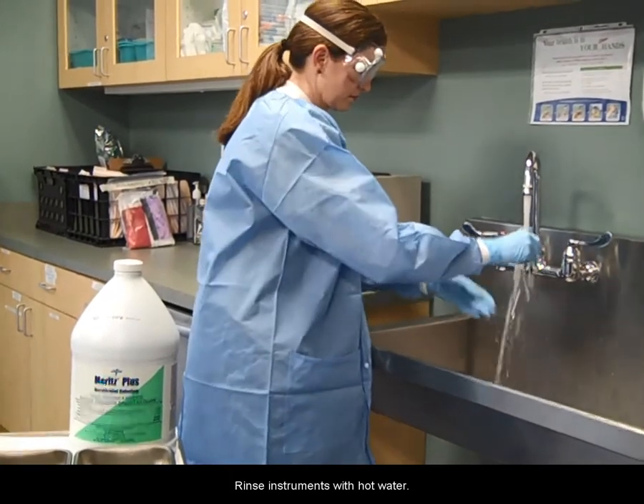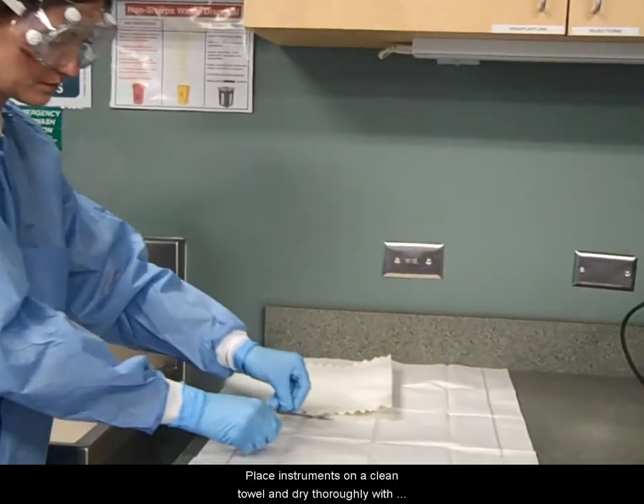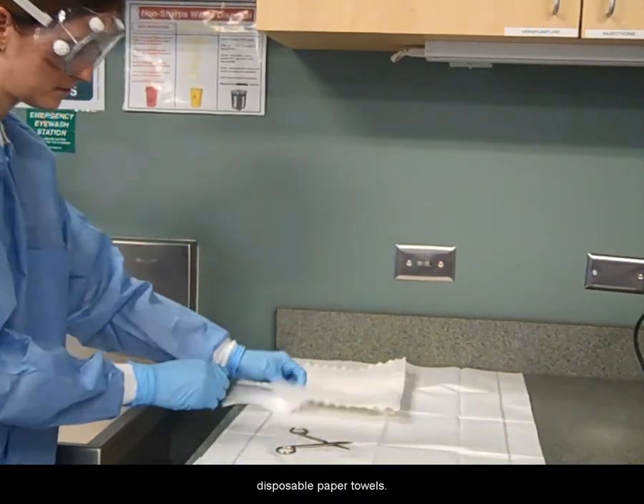Rinse instruments with hot water. Place instruments on a clean towel and dry thoroughly with disposable paper towels.